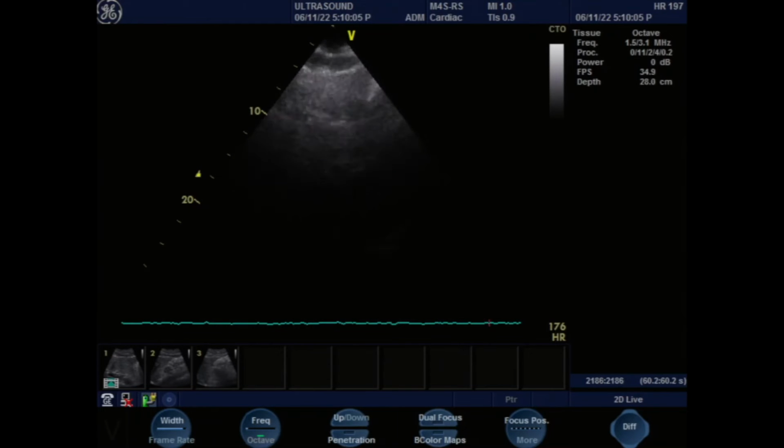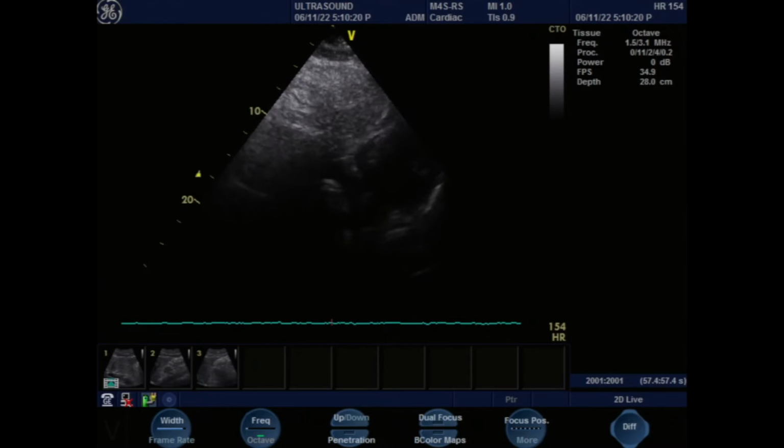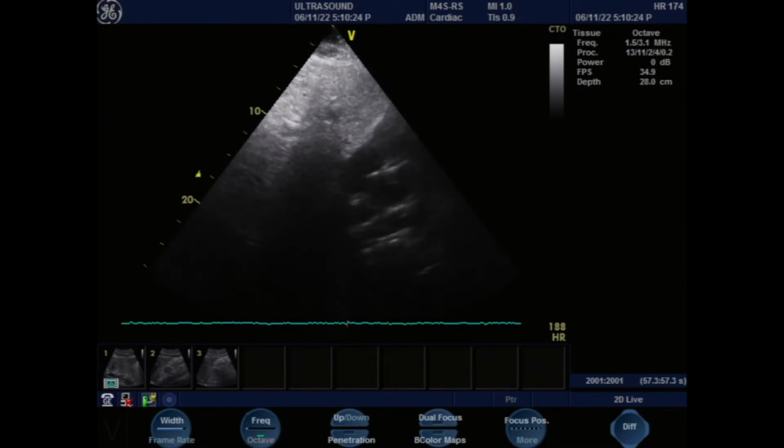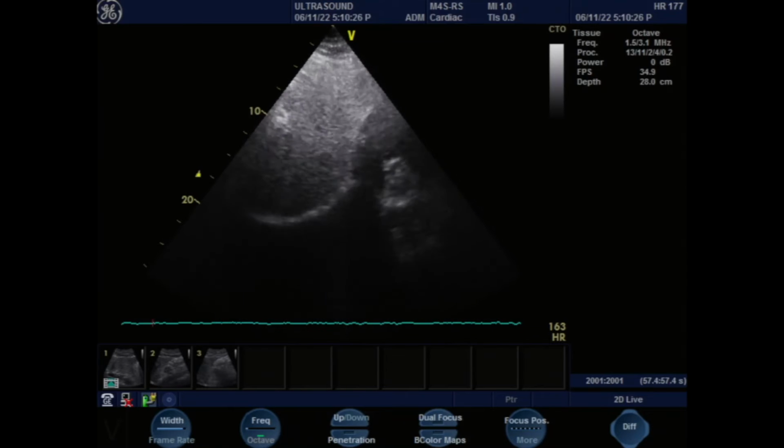Okay, so I'm sorry, I might be squeezing. I'm pushing a little bit harder on you. All right, so I'm just trying to see if we can get this in him. Turn the gain up a little bit. Here, this is not very clear, but I just turned the gain up a little. Yeah, you can increase the gain.